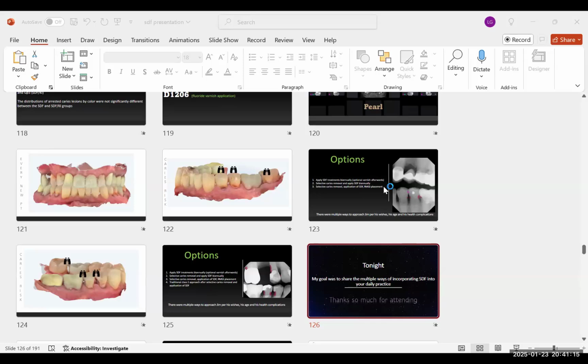But what is your favorite brand of glass ionomer? So that puts me a little on the spot. I've had great success with both GCs and SDIs. I think it's a bit of feel and the way you want to do it. Now, openly, if you're using an RMGI and you don't have a triturator, SDI really doesn't have that answer for you yet, because GC America has a dual barrel syringe delivery system for an RMGI.